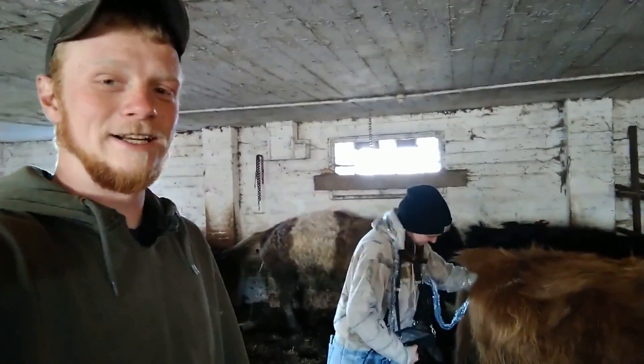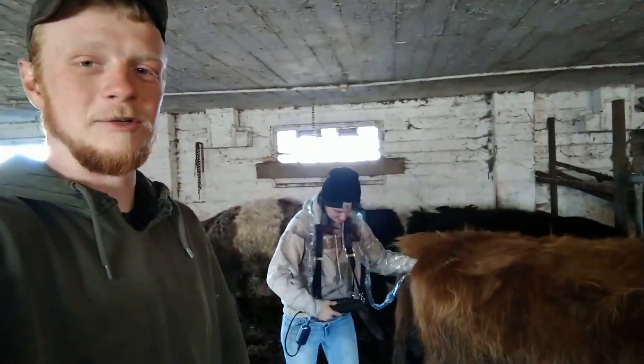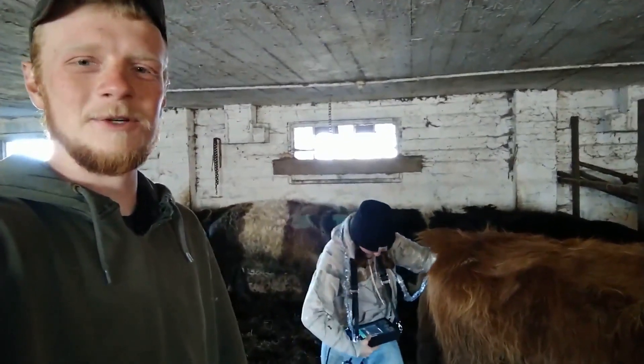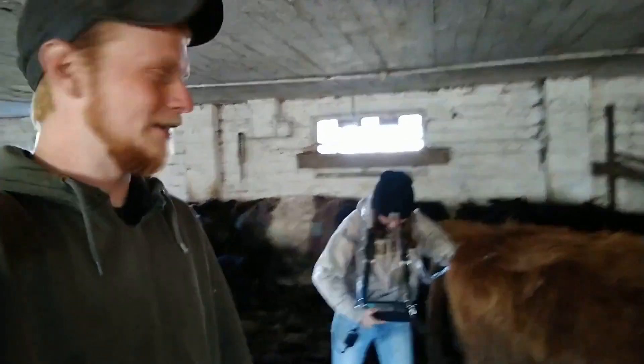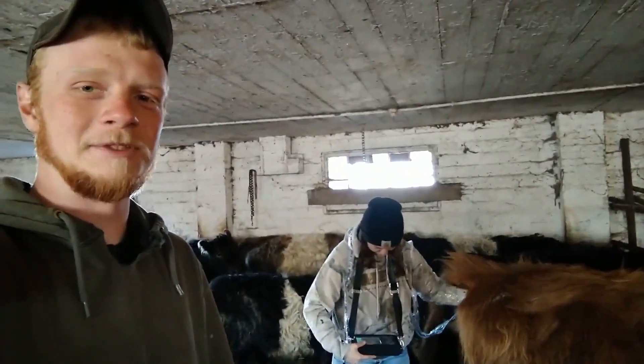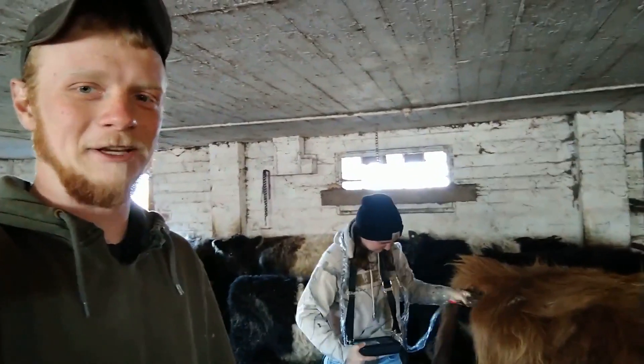Hi guys, Logan and Carrie Lynn here again, just doing a short preg checking video. The reason we're doing another one is we're using a different method today. Carrie Lynn's got this nice handy ultrasound machine, picked it up off Amazon — not cheap, in case you're wondering.